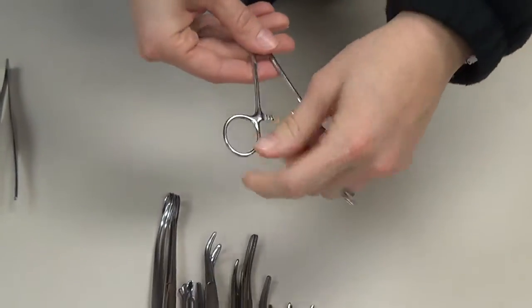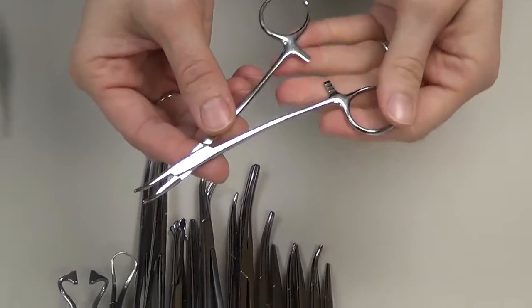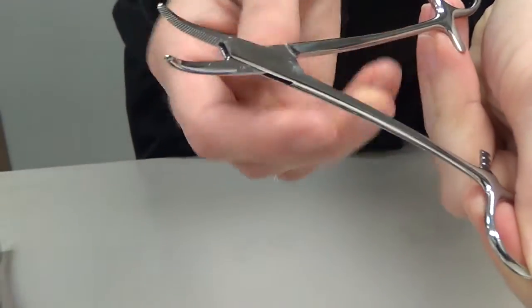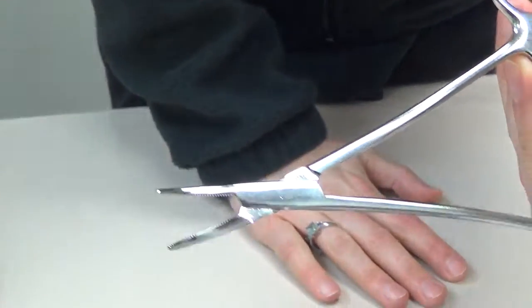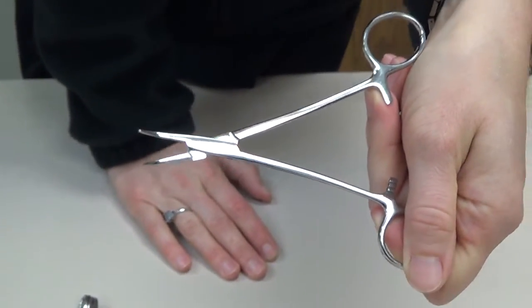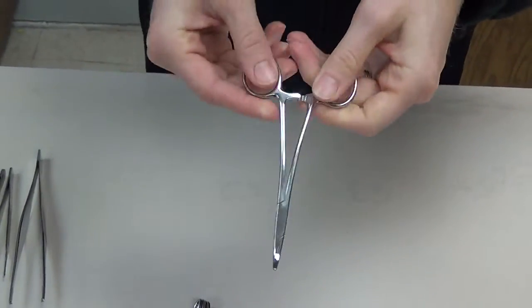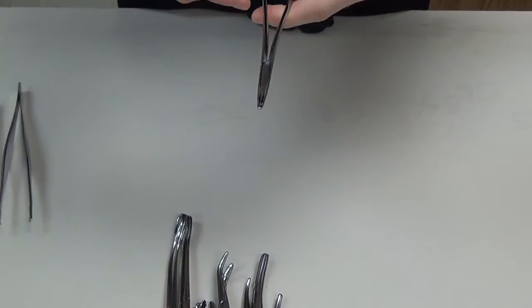This next group of instruments we're going to talk about is our clamping, occluding, and grasping instruments. The very first is what's called a mosquito, which is the smallest of what we refer to as hemostats. Hemostats are utilized to occlude tissue, vessels, ducts, and various structures prior to resecting or cutting them. They can also be utilized for blunt dissection, where we open the tips to separate the natural tissue planes within the human body.